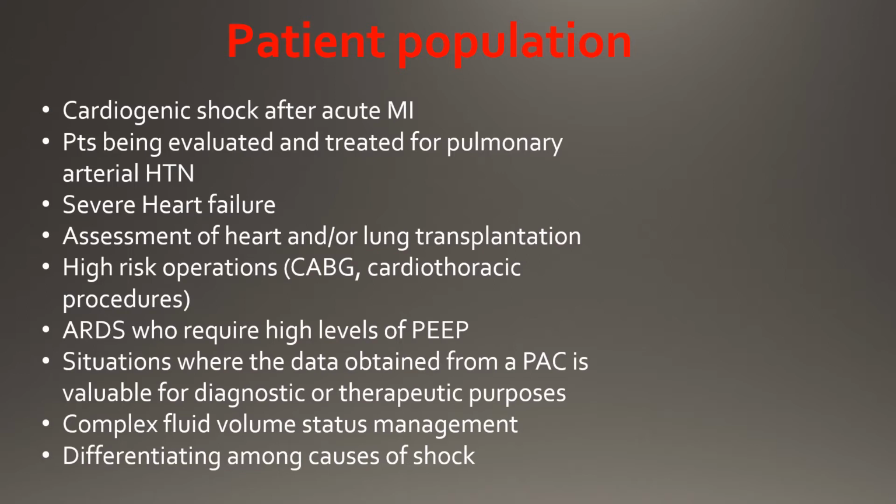There's several different patient populations that can actually benefit from a PA catheter, and I'll let you read those for yourself. The major thing to note about PA catheters that's different from your typical central line is that these are for diagnostic purposes and not therapeutic. I'm a visual person, so we're going to draw a big green circle around diagnostic and a big ol' X over therapeutic.